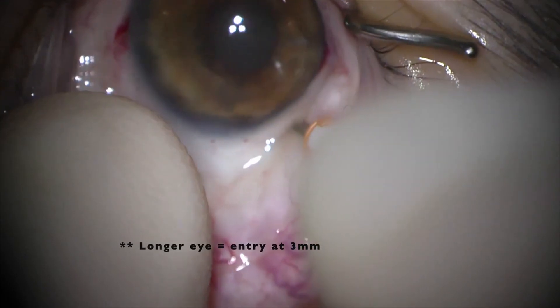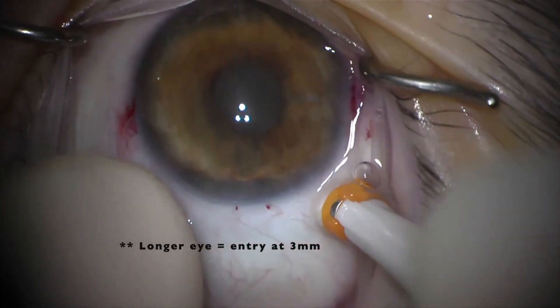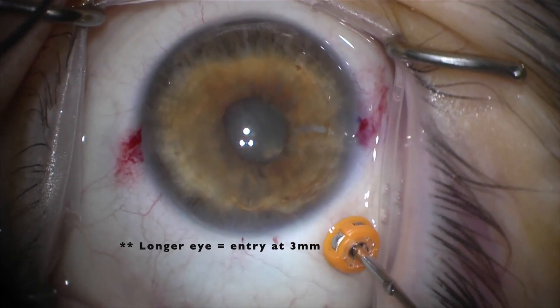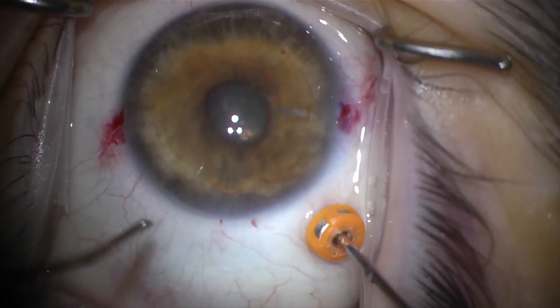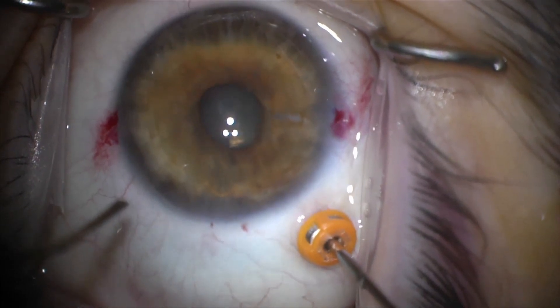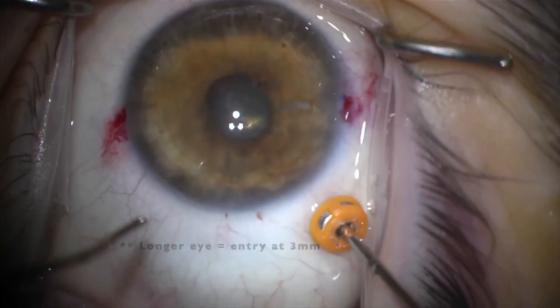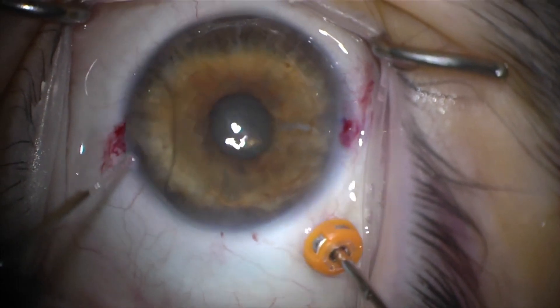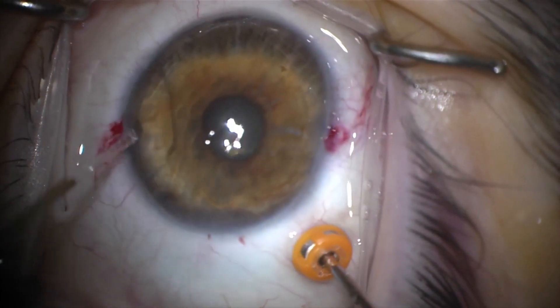A 23-gauge trocar is placed approximately 2 mm from the limbus. The cutter is aimed at the mid-vitreous cavity away from the lens, and vitrectomy is performed with the cutter port in view. This is performed dry with no irrigation.